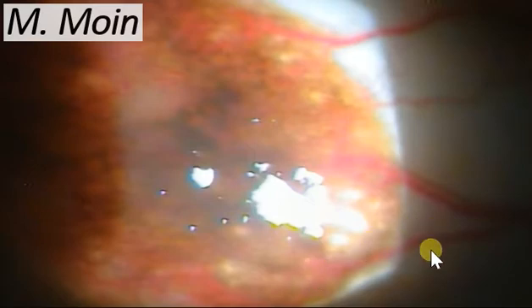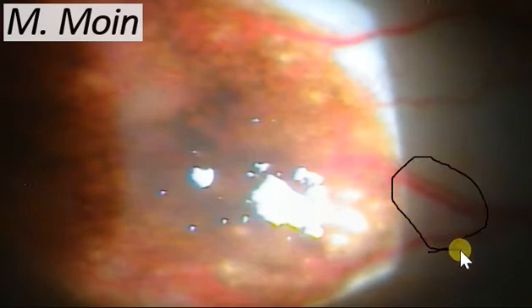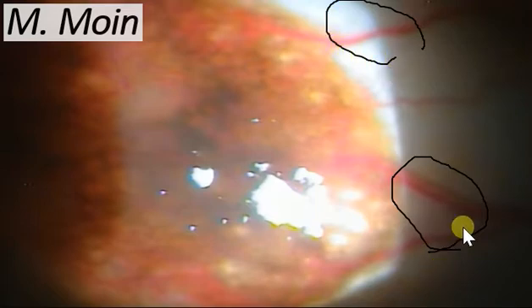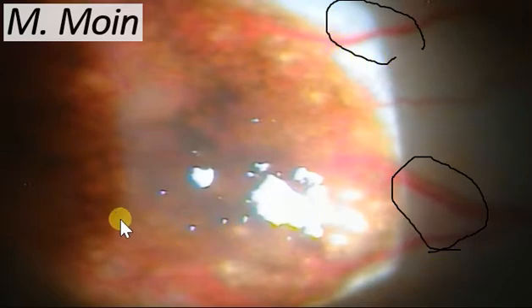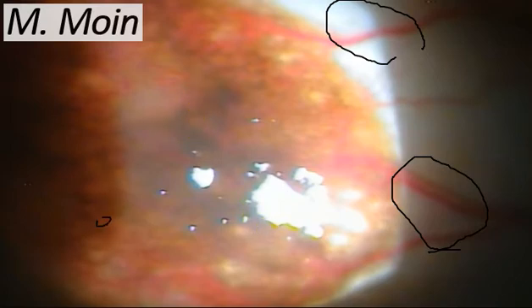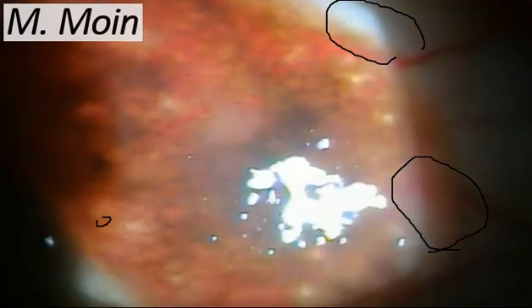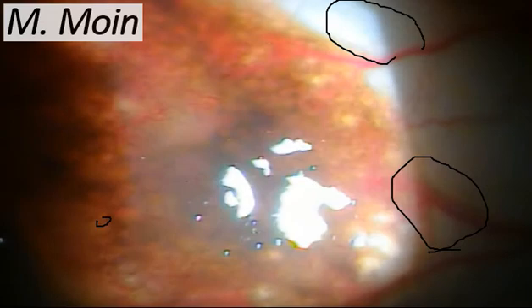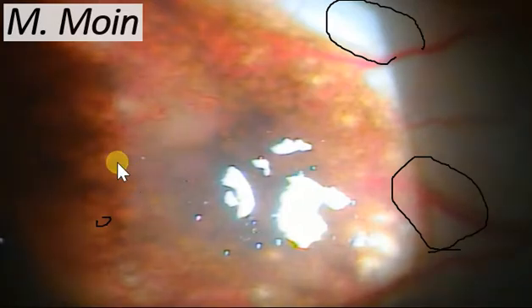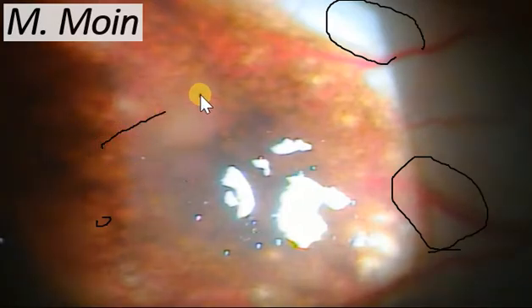The only thing which is looking slightly abnormal are these feeder vessels coming in, and these cystic spaces are definitely present. The patient also has telangiectatic vessels on top of this area, which you can see here — these telangiectatic vessels are present in this region.